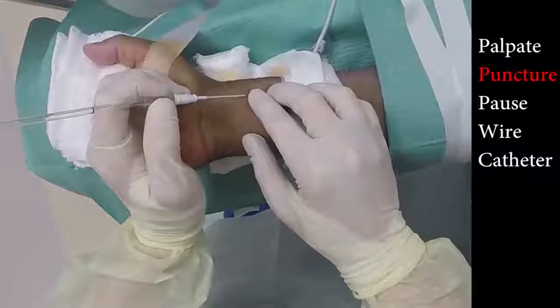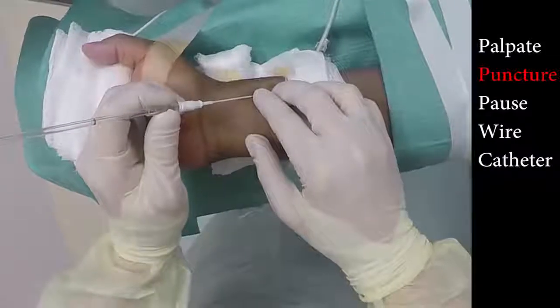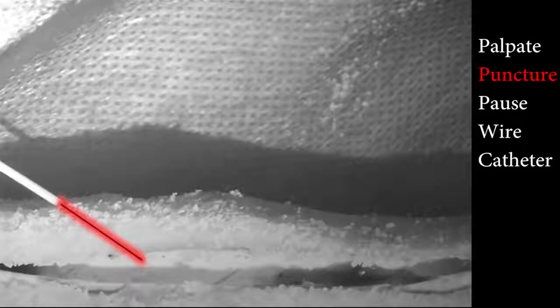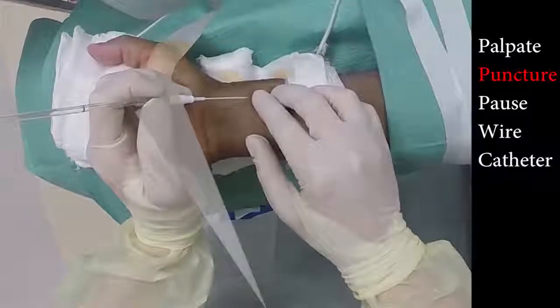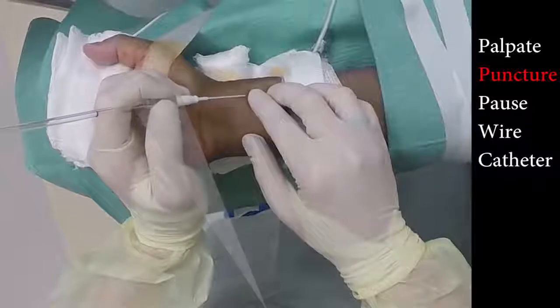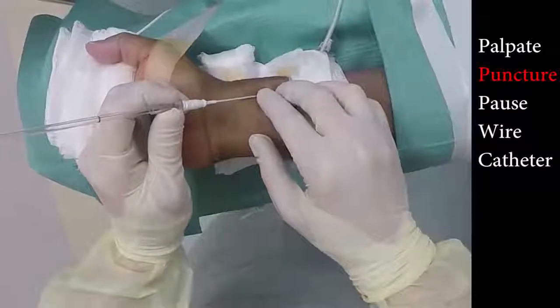Step 2. Puncture. Grip the Arrow with your thumb and index finger at the base of the catheter. Puncture the skin at 45 degrees using firm pressure to overcome the resistance of the skin. When using the Arrow kit for arterial puncture, you must constantly be focused on the piece of the catheter between your two fingers. This is the first area to fill with blood and will be your first indication that you have successfully punctured the artery.